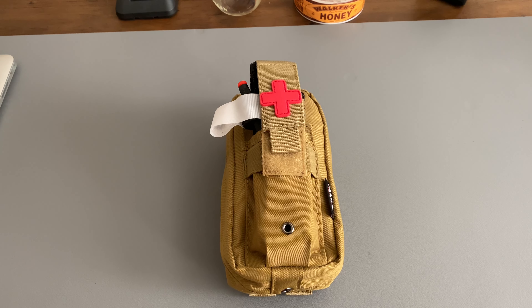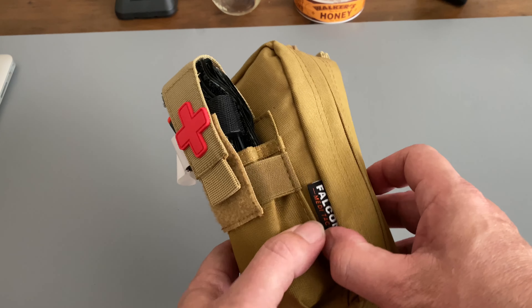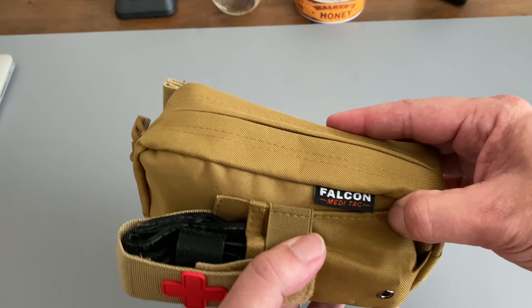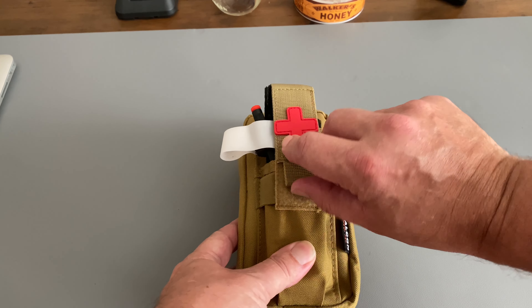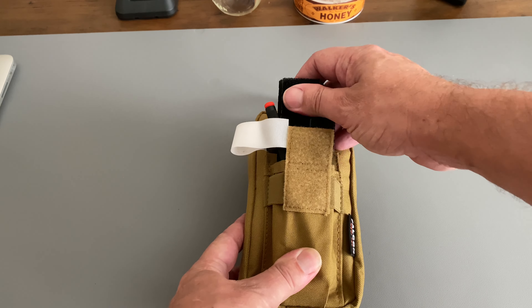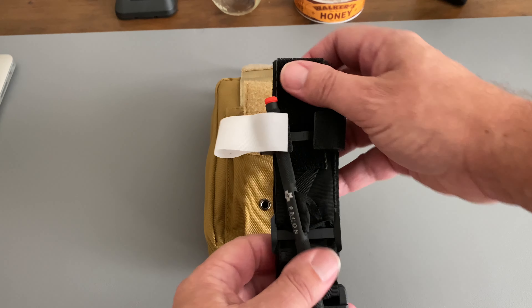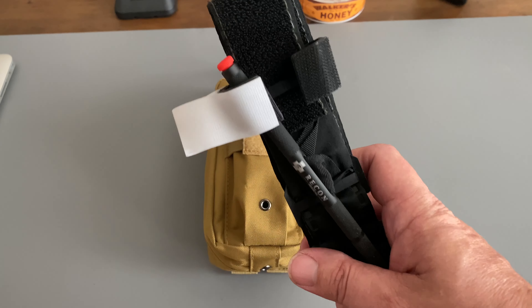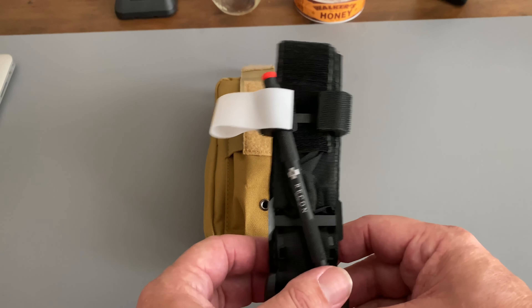Alright, so here we have it guys. This is what I thought should go into a trauma kit. Of course the bag from Falcon MediTac, and right here on the outside, right off the bat, you have your tourniquet. This is already staged for one-handed use. I did a video on that earlier — you can jump back and check that out.